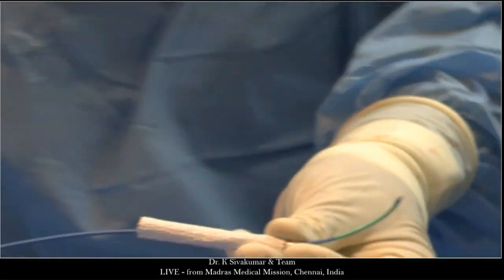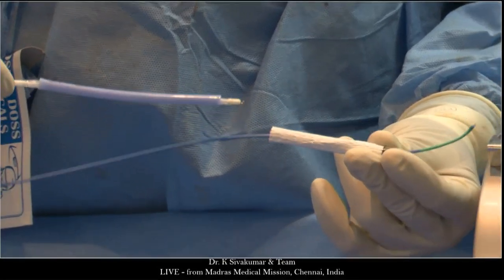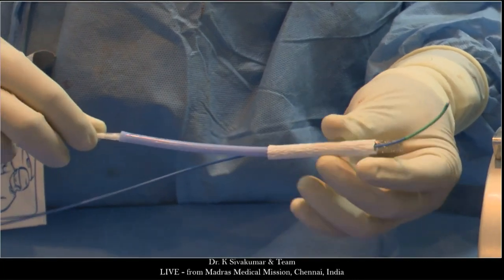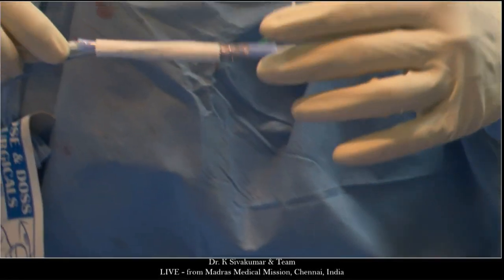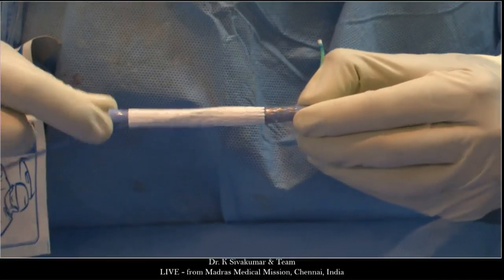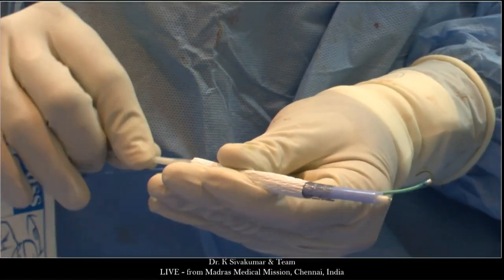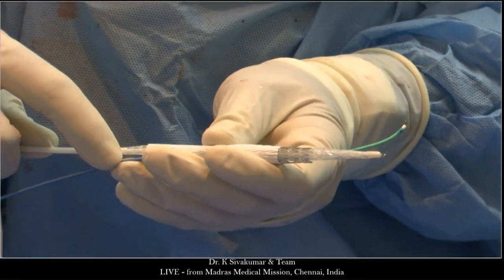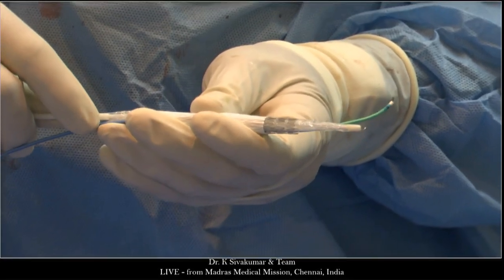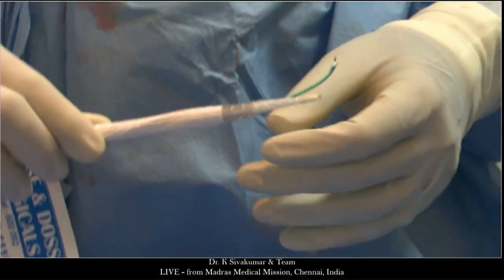So now we are going to be loading. This is that same 24 millimeter balloon. So I am taking this 24 millimeter balloon inside this covered stent. I am peeling off the sleeve. So the sleeve of the balloon is peeled off. I get the balloon centered. So this is an 8 centimeter long Z-Med balloon, the same balloon that we did the balloon testing.